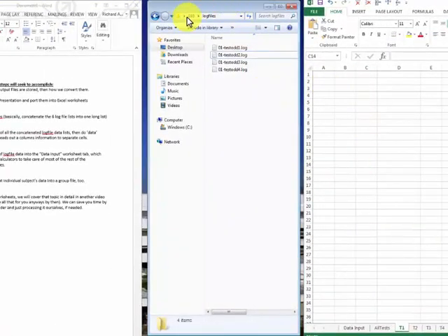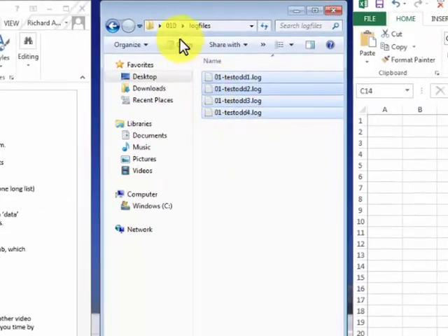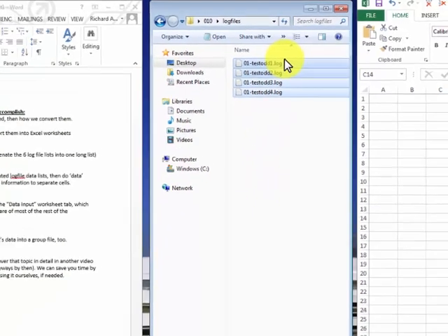In this case, we have our log files from each of those 4 respective test sessions. They're going to live basically in this folder for our experiment. In this case, it's going to be experiment 010 or perhaps 011, depending on which version you're running. And it's going to have these 4 different outputs of just simple log files.